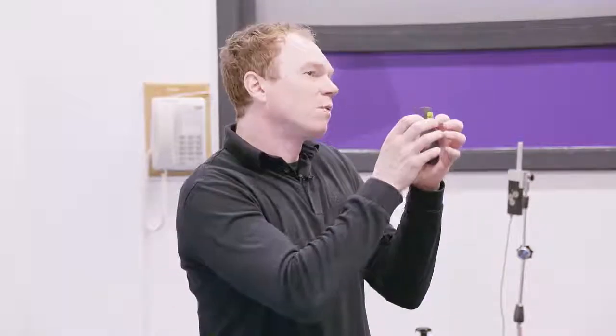Because what you're looking for is the area of the muscle belly where you will have the biggest displacement, where you will have a lot of muscle fibers coming together, forming a deformation. So this is something that you always need to consider when you're positioning the sensor. You cannot put it just anywhere on the muscle, but even if you use the EMG, you have to follow the same standards. So yes, it will affect.